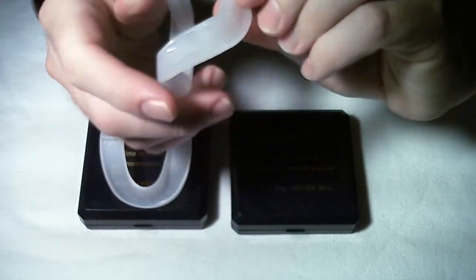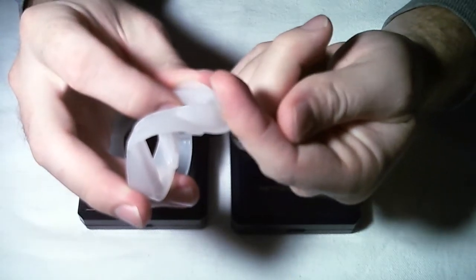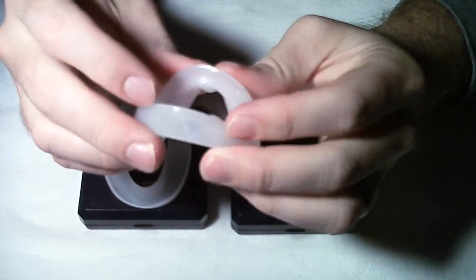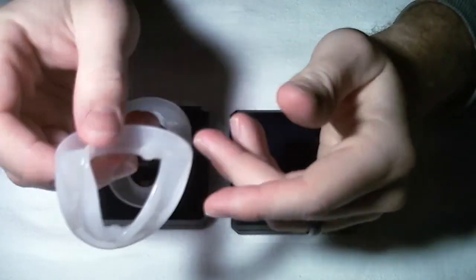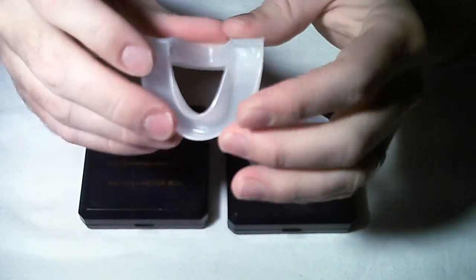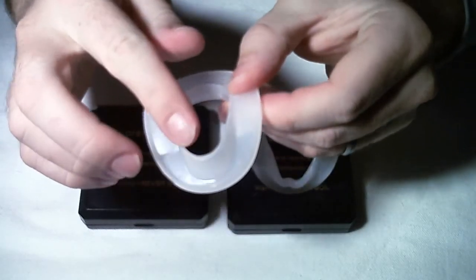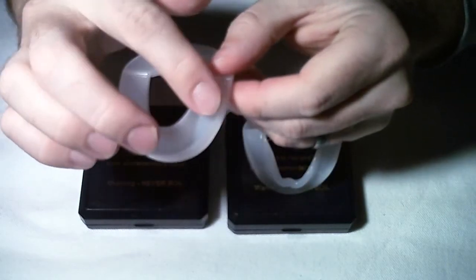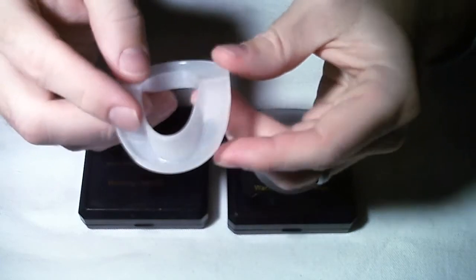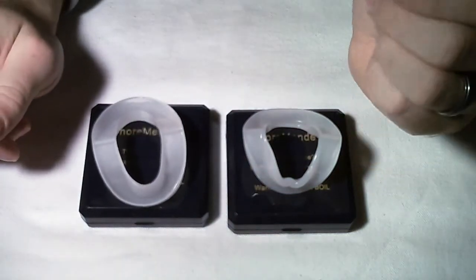And then what it did was it actually flattened out this lower portion here. It used to stand a bit more straight up, but it kind of flattened it down. So that helped it fit. It stopped popping out after that. So that took care of that problem. With the original, I didn't actually have to do any modifications to it, except I took a nail file and filed these edges a bit around here to make them a little bit smoother, because they are kind of on the sharp side. They irritated my gums when I initially put it in, but after filing it down, that helped out quite a bit. So they both did in fact work.